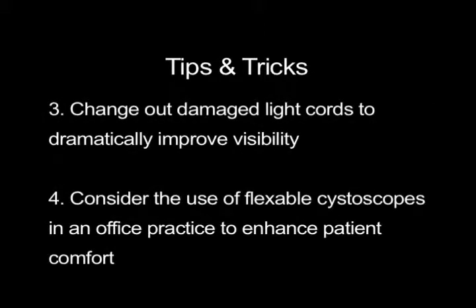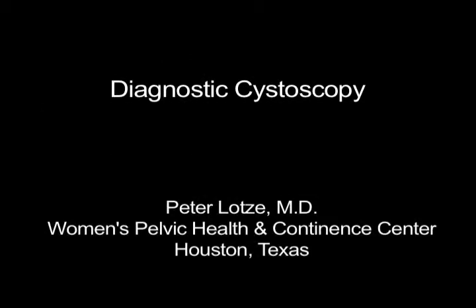Light cords are frequently damaged. As a result, visualization can be greatly impaired. Change out your light cord as you need to. If you intend to perform office cystoscopy, consider the use of a flexible cystoscope, which can enhance patient comfort while the patient is awake. The performance of routine cystoscopy in gynecological surgery can improve the physician's ability to diagnose intraoperative pathology or discover pathology not suspected in an otherwise healthy patient.